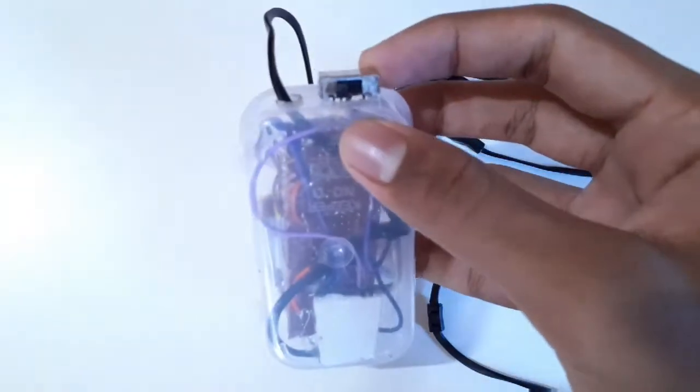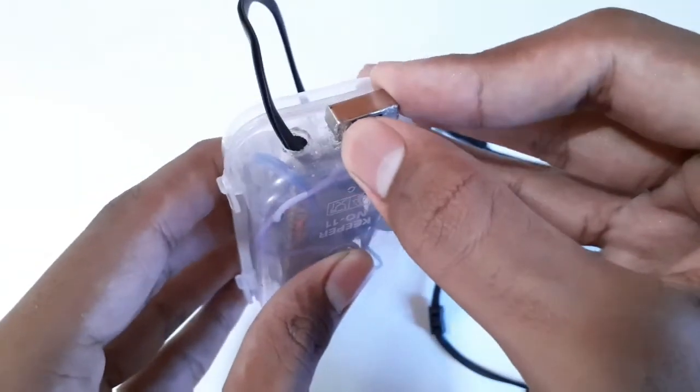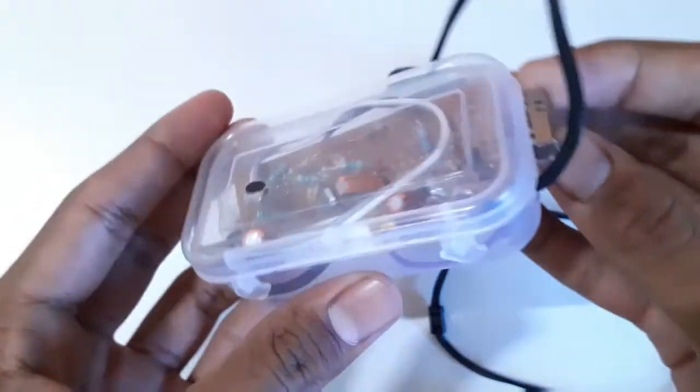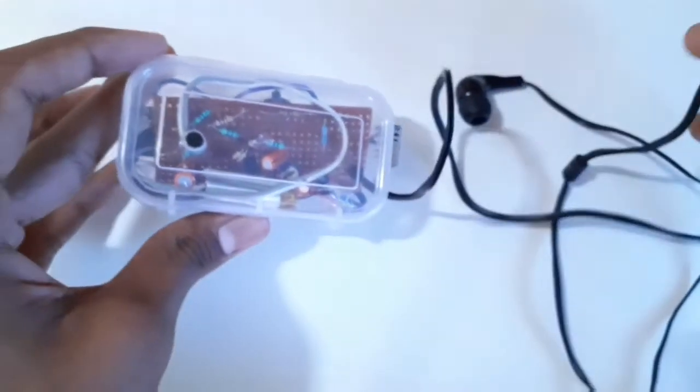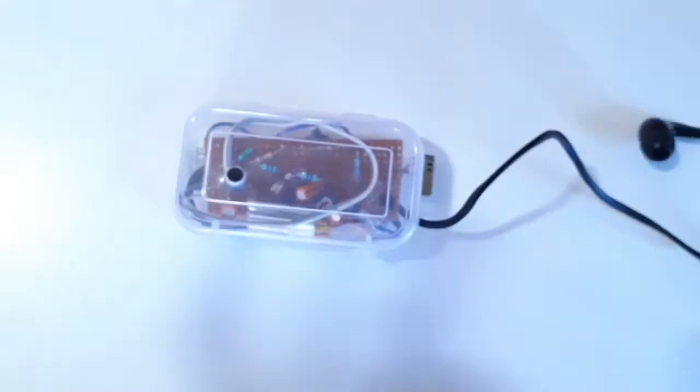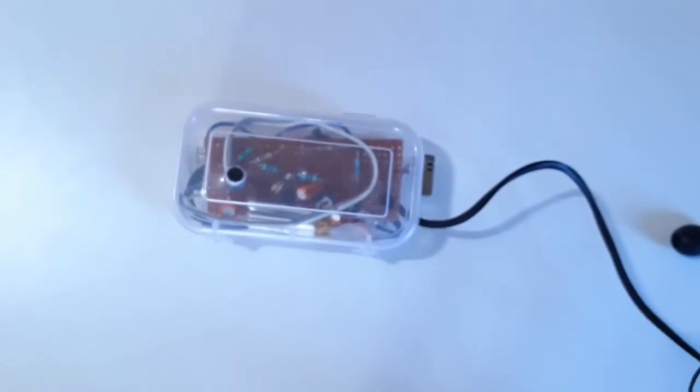Now you can charge this device from the charging board and turn it on and off using the switch. Now let us test it with a simple example.